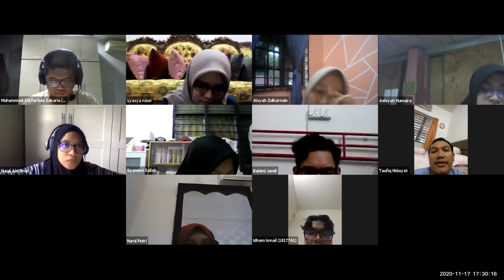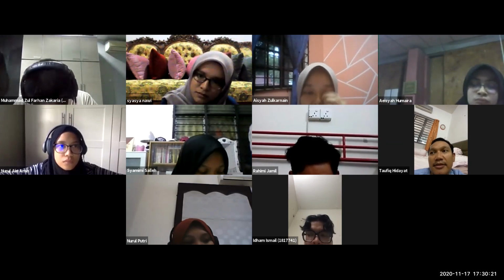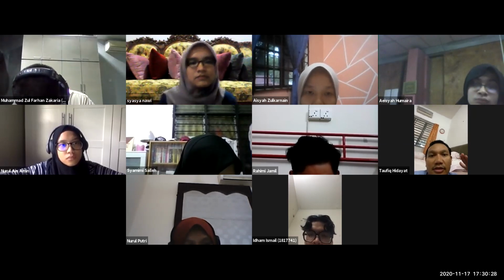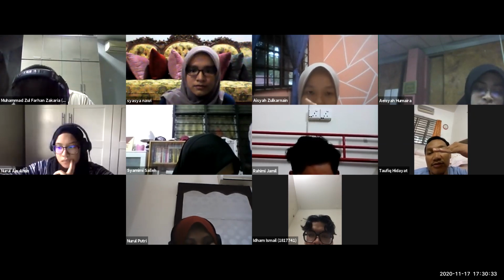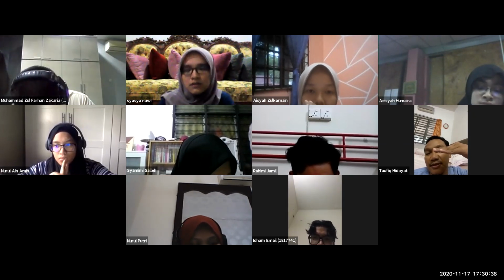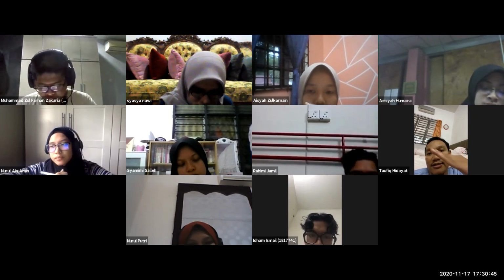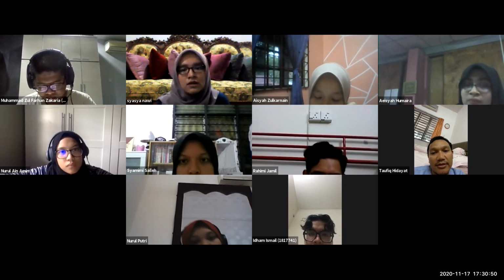So kena go near to the, for example you ambil L2 tu, near to the L2, ke atas dia. So that's why tadi nampak the picture tu, dari tepi dia akan nampak near to the upper vertebra, and then cucuk straight, and the direction is not 0 degree horizontal position relative to the vertebra, but actually quite like upper angle, sudut ke atas sikit.